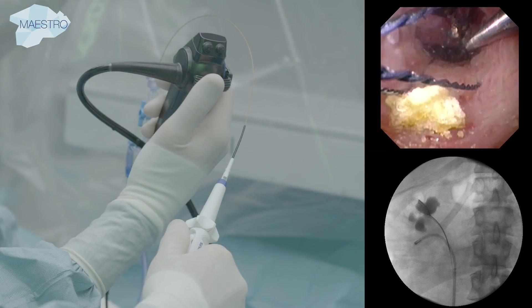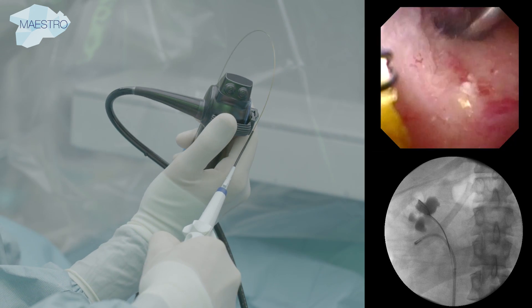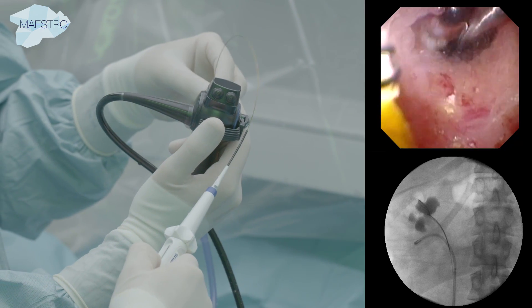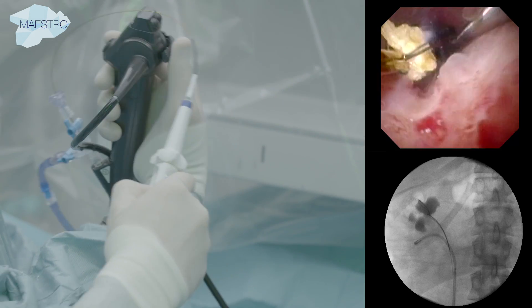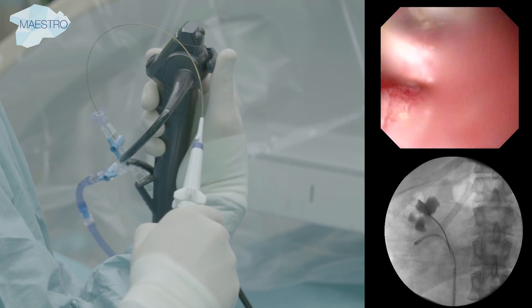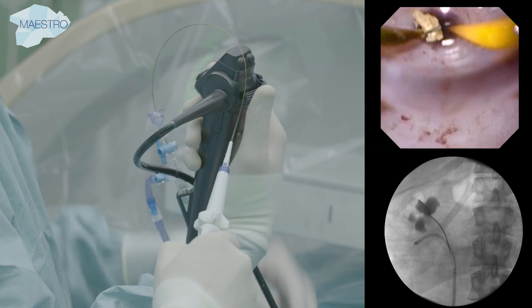The basket is used to catch and retrieve stone fragments, always under endoscopic vision. We remove some fragments for stone analysis, and the rest of the fragments are left for spontaneous expulsion.